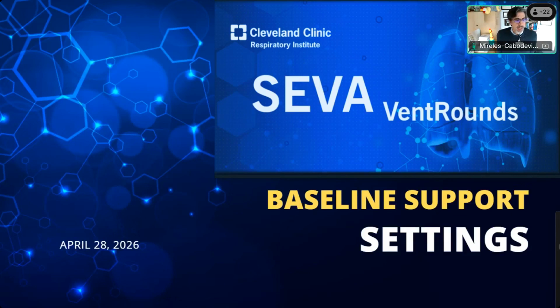Today's April 28th, 2026, and this is SEVA VentRounds. Today we're going to focus on a case that comes all the way from Mexico, and it's really nice to review some of the concepts that we now use. So we're going to focus on baseline support and some of the settings that we use.